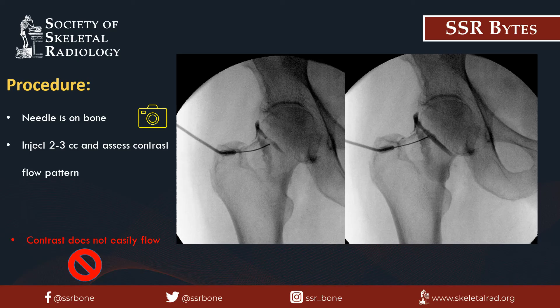Once the needle is on bone and fluoroscopic images have confirmed placement, the stylet can be removed and contrast can be injected. There should not be much resistance with injecting the contrast — it should feel as if the contrast is flowing smoothly. If it is difficult to inject contrast and you are in the appropriate location on fluoroscopy, try putting the stylet back in and turning the needle. If it is persistently difficult to administer contrast, you may have to reposition the needle. Note the contrast flowing away from the needle and surrounding the femoral head-neck junction, and contrast extending distally within the hip joint along the femoral neck.